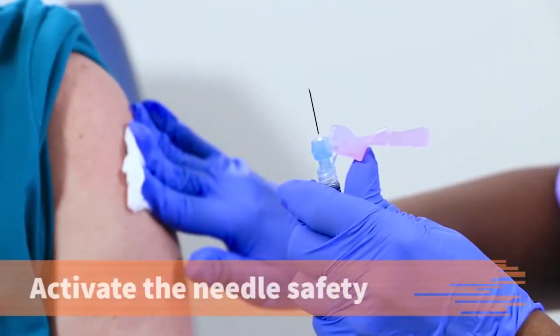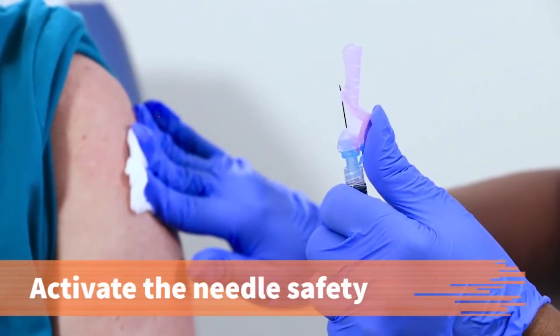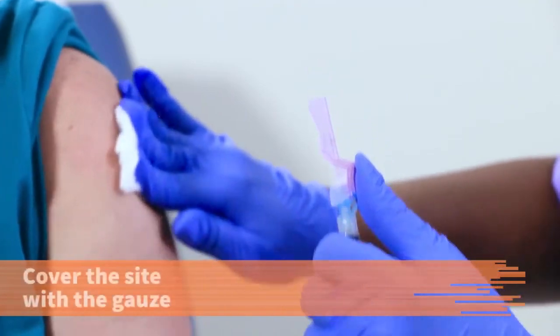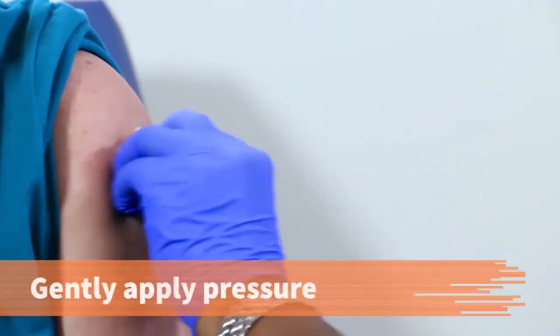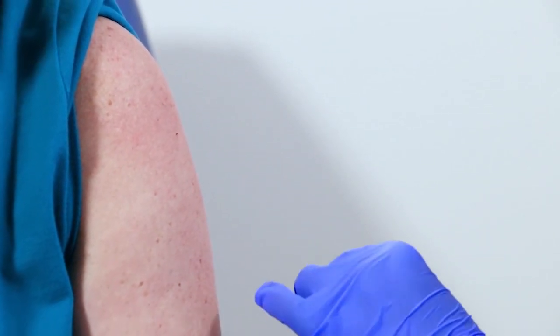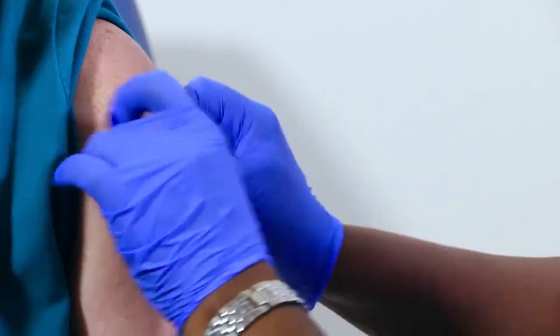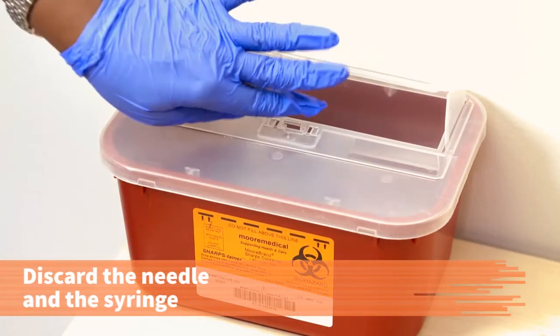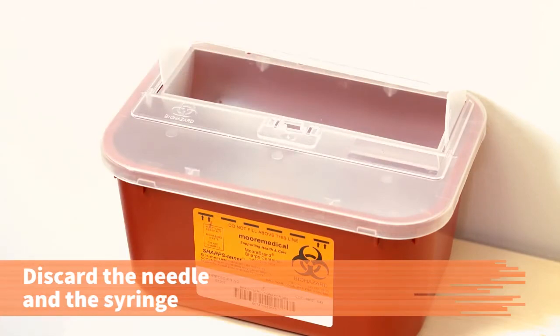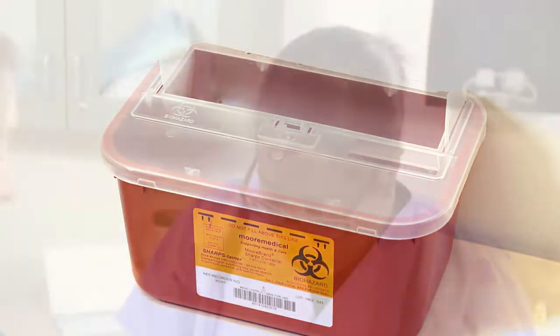Activate the needle safety device with one hand while the other hand covers the site with gauze. Gently apply pressure at the site to stop any bleeding. Apply a bandage if the patient requests it. Remember that some bandages may contain latex, which can be an allergen to some people. Some people may be allergic to the adhesive. Discard the needle and syringe in a biohazard sharps container. Make sure to put the needle in first.